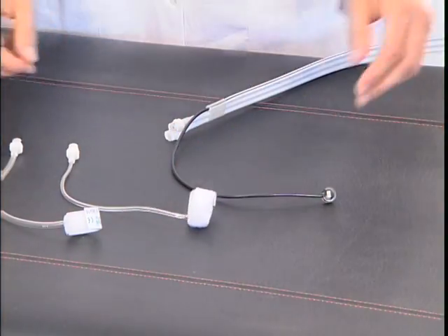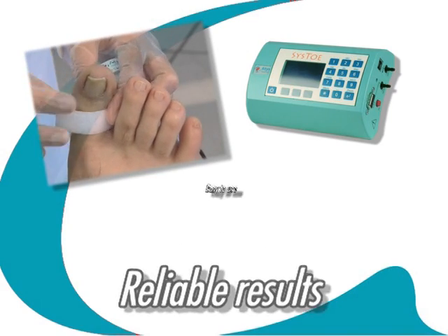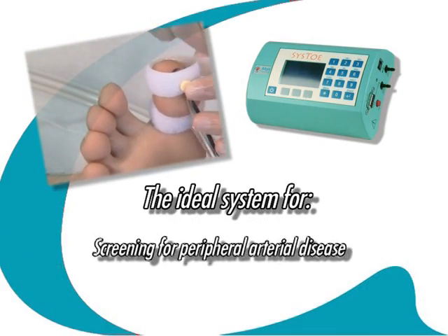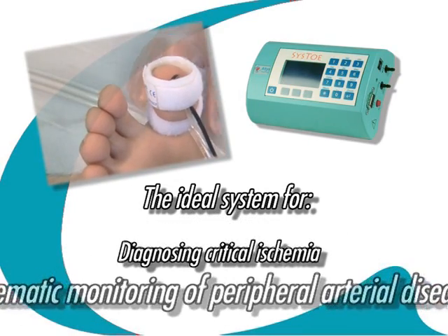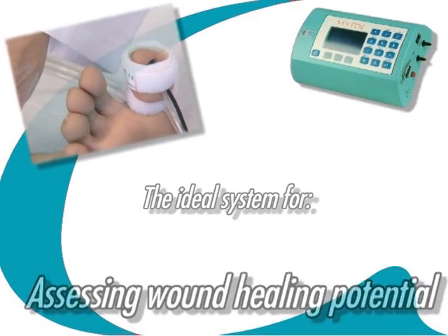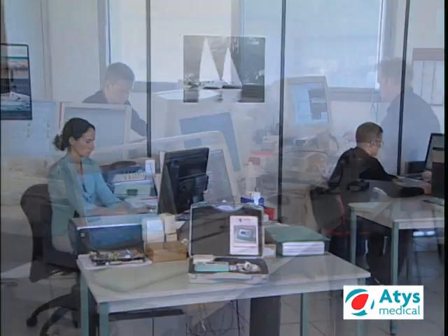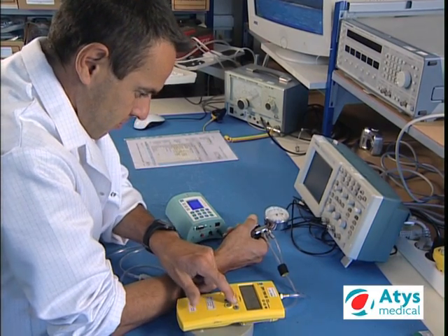The Cysto substantially improves the reliability of distal blood pressure measurement. Its ease of use, together with the low cost of both device and the measurement procedure, make it the ideal system for screening for peripheral arterial disease, systematic monitoring of peripheral arterial disease, diagnosing critical ischemia, and assessing wound healing potential in a patient with a trophic disorder. The Cysto is the fruit of all the experience of the Atis Medical R&D department and its production workshop.